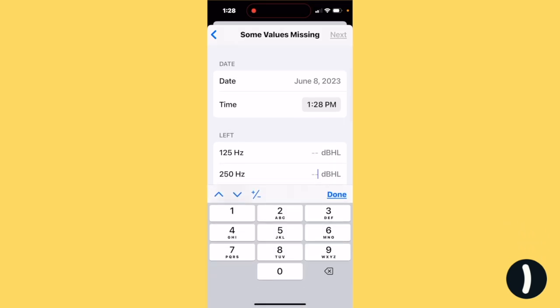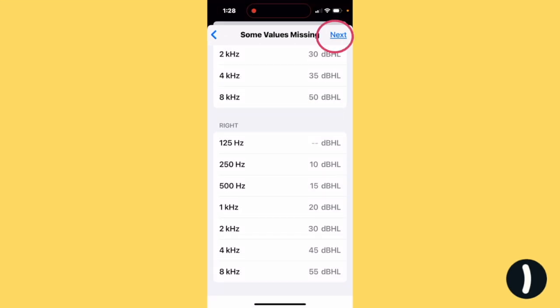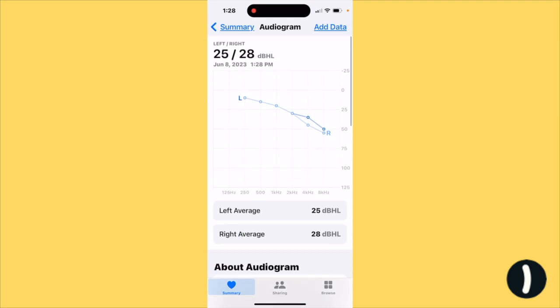Grab your hearing test and add the values. Hit Done, hit Next, then Save. Your audiogram is in.